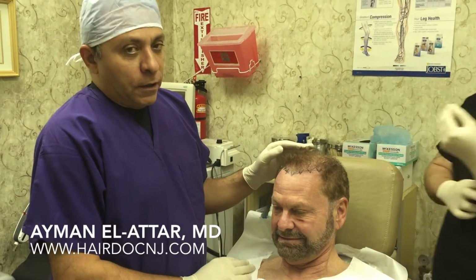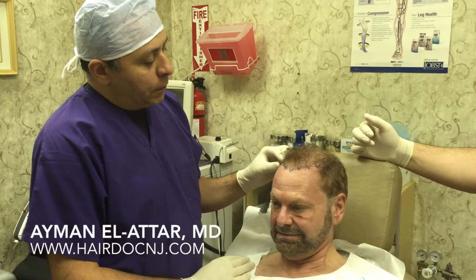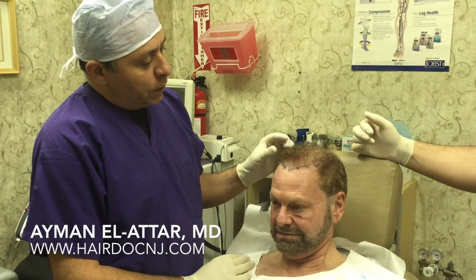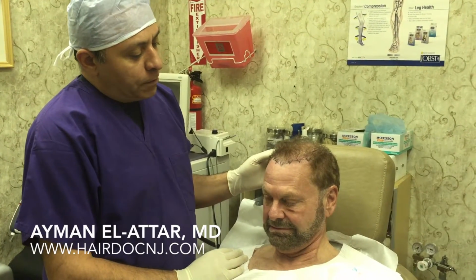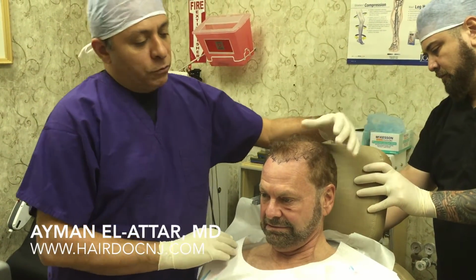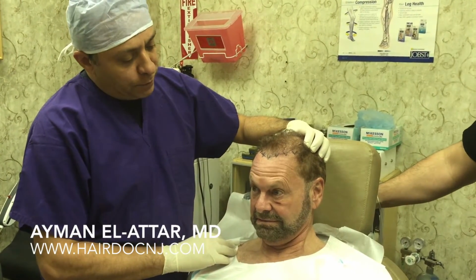So Jeff is here with us today, and we are actually putting the grafts in the frontal hairline. Hairline design is very crucial to give a natural appearance of the hair transplant. So one of the simple tests for us to know how far we should go with the hairline is to ask the patient to raise his eyebrows up.